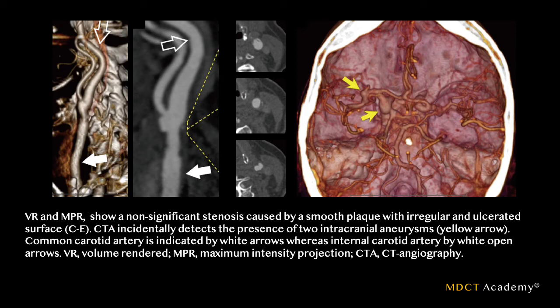This next image series also shows an ulcerated plaque. On the axial images from superior, middle, and inferior levels, you can see that the plaque wall varies — it may appear smooth at one level but irregular or ulcerated at another. You cannot assess ulceration from a single slice; you need to review a series of slices. The images to the right show a 3D volume rendering of the circle of Willis, incidentally demonstrating two tandem aneurysms not initially part of the carotid CTA focus.